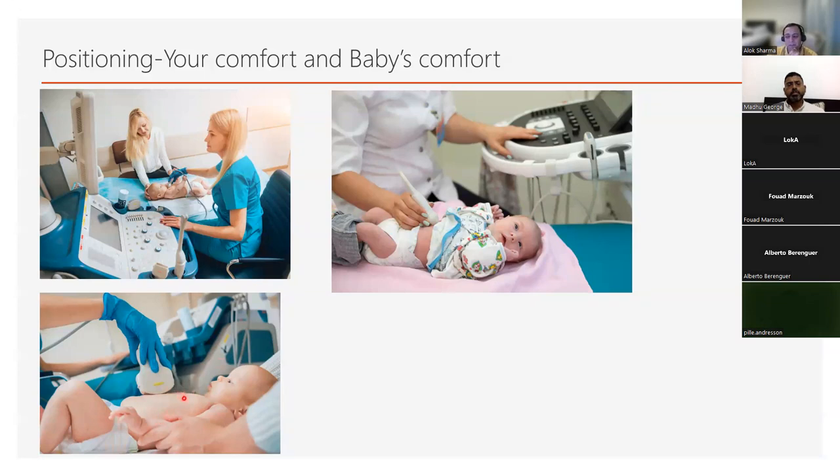I'm just going to give you an example here of how that affects your scan. In a pneumothorax, air rises anteriorly and laterally. Now, if you're trying to quantify whether this pneumothorax is mild, moderate, or severe, you're really looking at the extent of the pneumothorax up to the anterior and then to the posterior axillary line. Now, if you move your baby into a lateral position to try and get the lateral areas, naturally air will rise up into the lateral area and you will overestimate your pneumothorax.